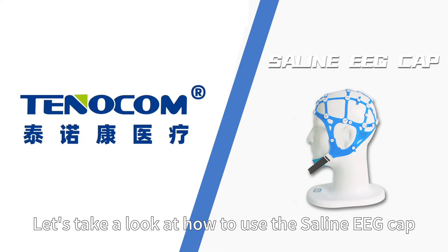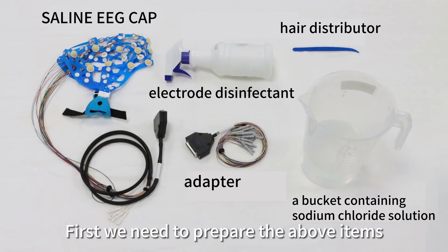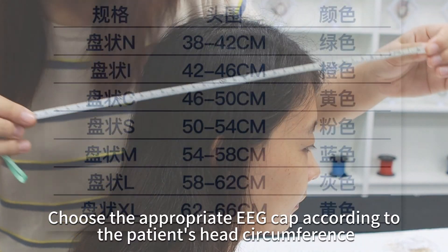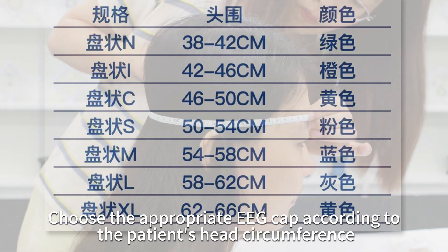Let's take a look at how to use the saline EEG cap. First, we need to prepare the above items. Then insert the marked electrode wire into the corresponding terminal of the amplifier. Choose the appropriate EEG cap according to the patient's head circumference.